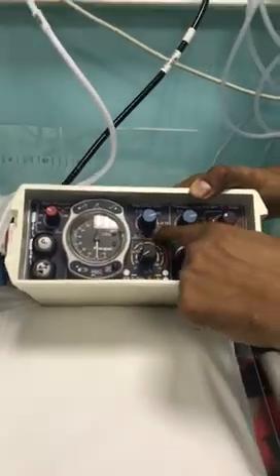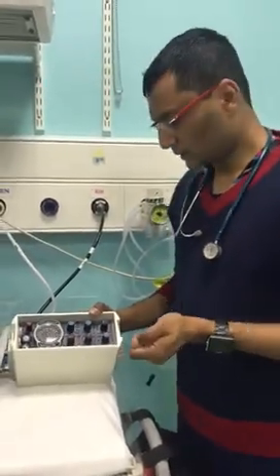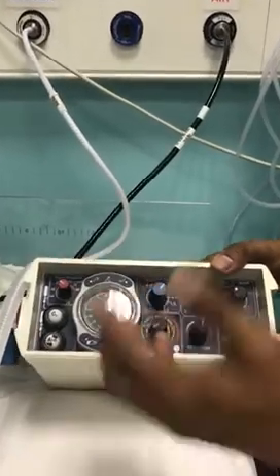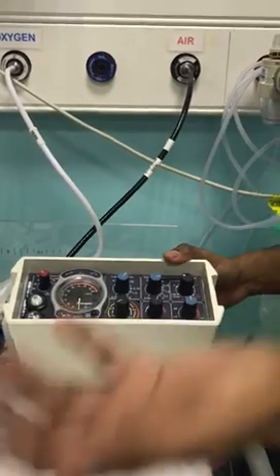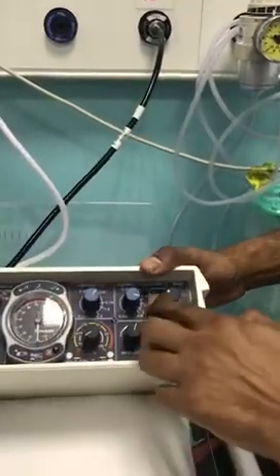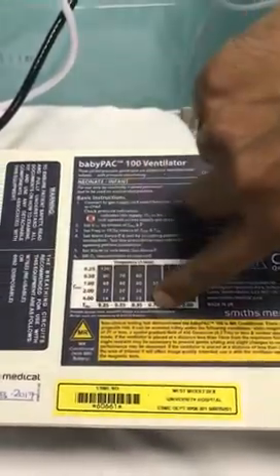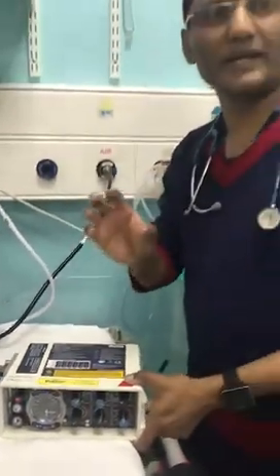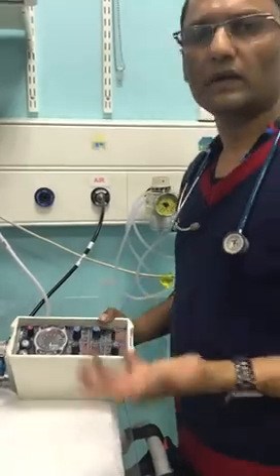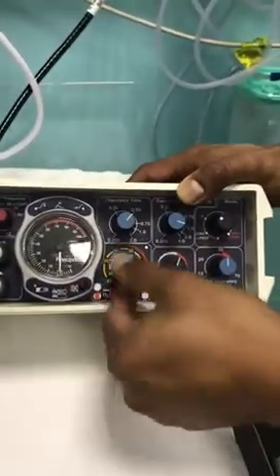The next dial is the inspiratory time. In this ventilator — the baby pack — you cannot set a rate directly; you have to set an inspiratory time and an expiratory time. Don't set a very small inspiratory time, otherwise the baby will struggle to breathe. Inspiratory time should be around 0.5 seconds. If you want a rate of 30 per minute, your expiratory time will be 1.5 seconds, giving a two-second cycle. If you can't remember at 2am, you can look it up on the machine. Usually do not ventilate babies at a very high rate — 30 is plenty.